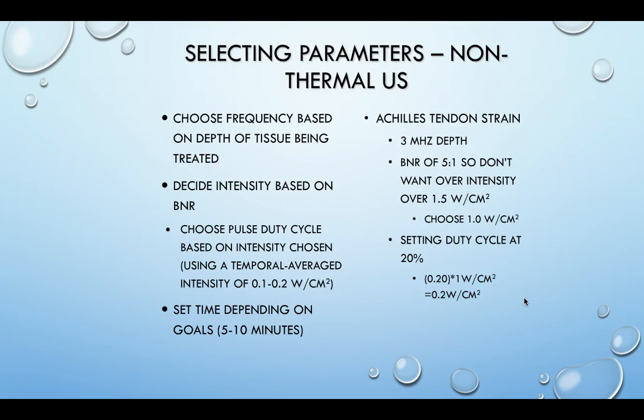So again, I usually recommend somewhere between 8 and 10 minutes. Some places go as low as 5. I just don't think you really get what you want out of 5. But research is kind of mixed on that.